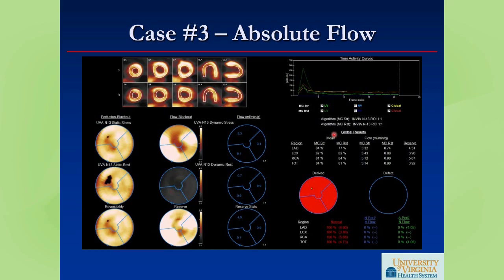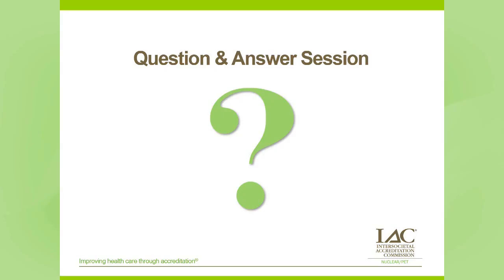So I think that there are definitely things that you can do in looking at those curves to make sure you have good data. And I think we would all agree that in the current situation, where we've been providing relative imaging without absolute flow for a long, long time, if you have any question about whether the absolute flow data is accurate, I would not include it. And I would just include a statement that says absolute flow numbers appeared to be artifactual and they're not reported, and be done with it.